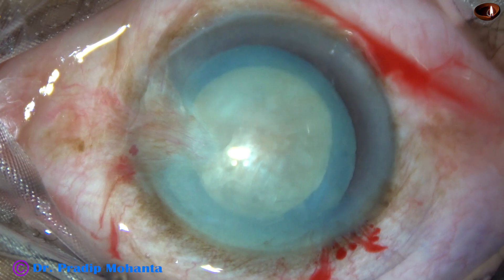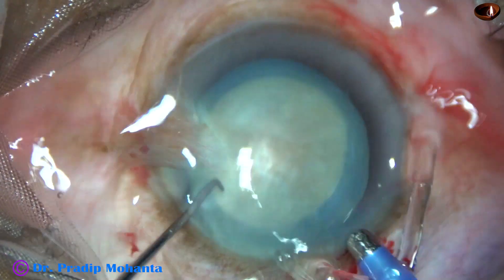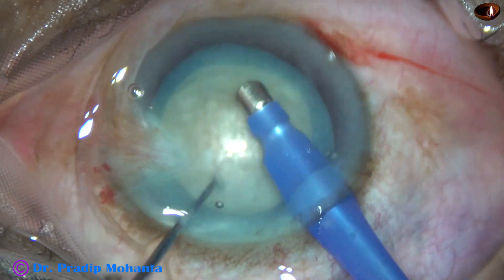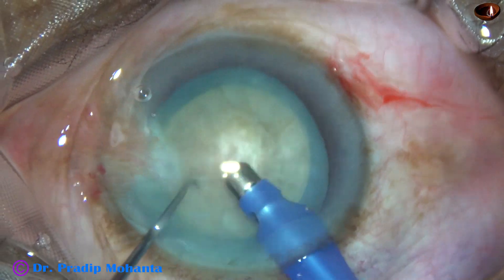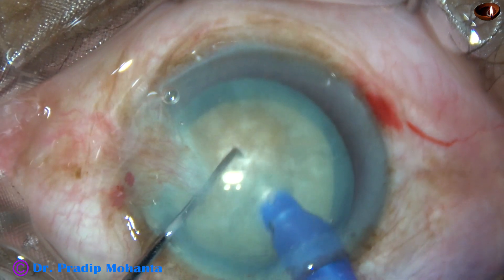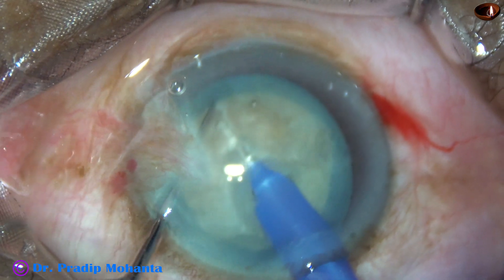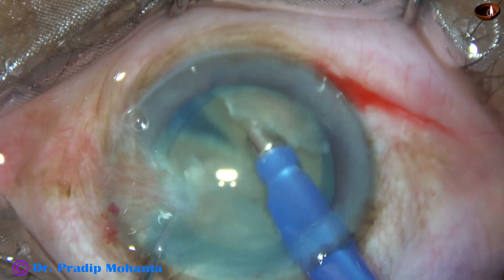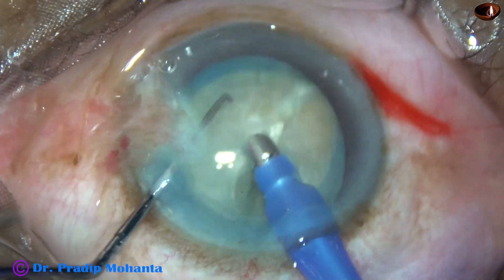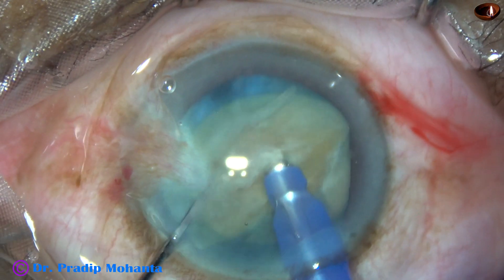As usual, the phaco needle goes in with its bevel down. Some superficial cortical lens matter is removed, and without turning the handpiece, I went inside the nucleus. This is a submarine chop with the bevel of the phaco needle towards the posterior capsule. And see, the nucleus is completely divided into two nice hemi-nuclei.